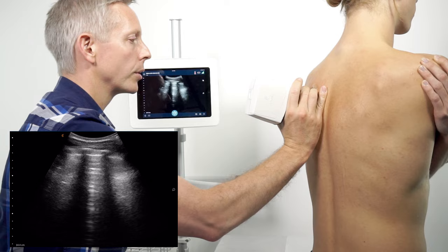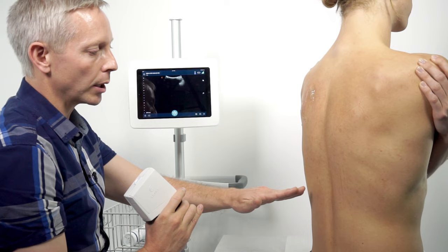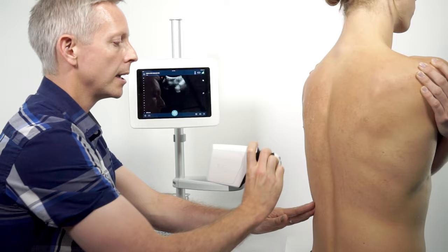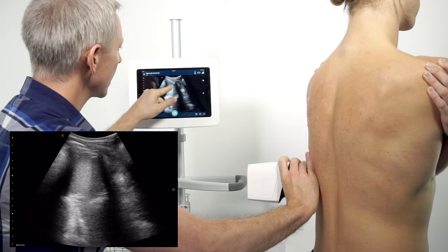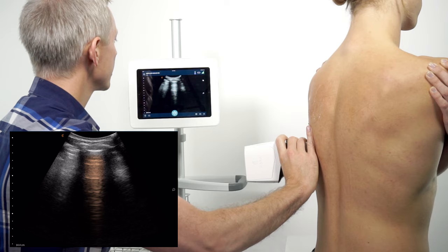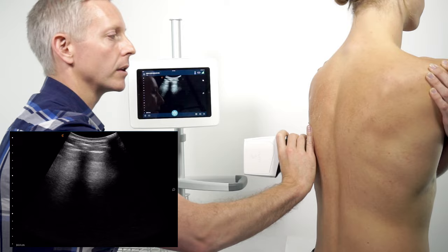I see those nice repeating A-lines, signifying a lung scan consistent with normal. Moving down to the inferior portion of the posterior lung, it's useful again to identify where the abdomen ends and the thorax starts. On the posterior left side, I'll try to identify the spleen first. Coming to the costal margin and placing the transducer just a little bit lateral, I can identify exactly where the spleen is. Then I'll slide the transducer back up into the thorax, looking at the nice sliding across the pleural line and A-lines repeating across the screen — consistent with a normal lung in the most dependent region while the patient is sitting up.